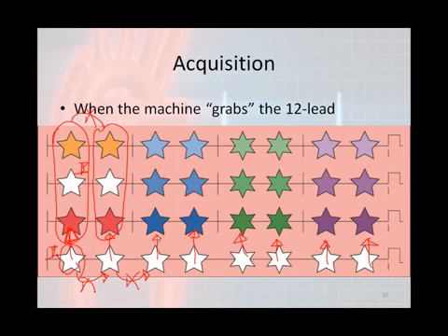Now, the reason that we do this is because if you need to interpret a rhythm and you have all kinds of ectopy or something else going on, you need to know what the underlying rhythm actually is. If you look at these stars over here, if you didn't know that this complex and this complex were premature beats or ectopic beats of some kind, you might not know that because it is in a different lead. It's actually switched.